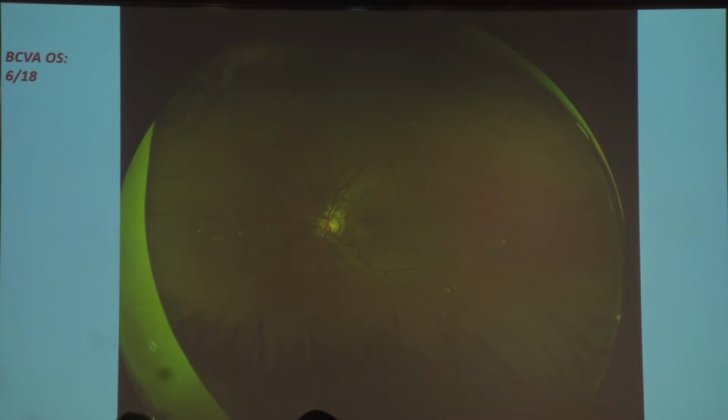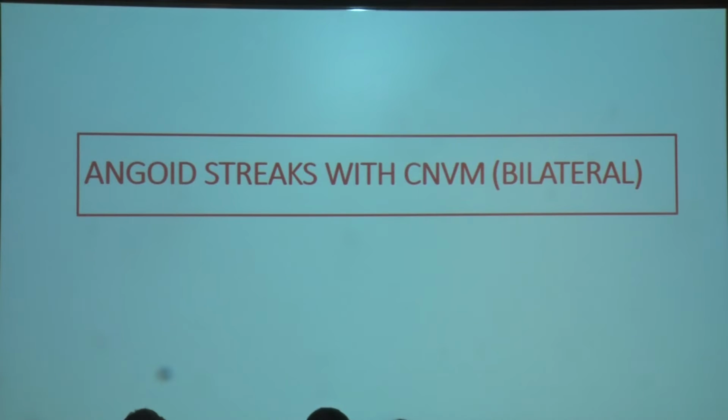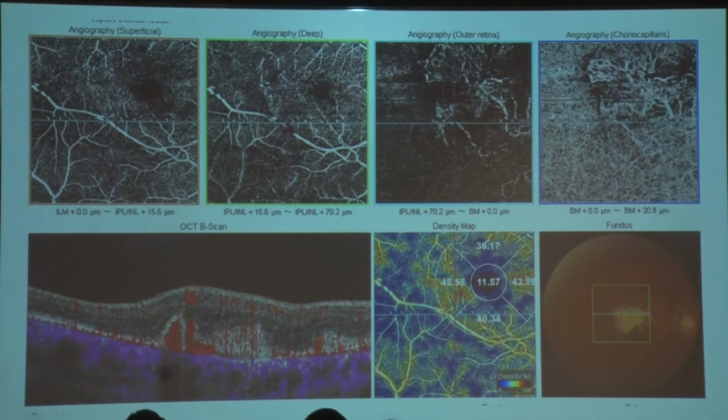When we look at the other eye, again a similar picture is visible. Black lines emanating from the optic disc and going radially outside. The left eye also shows some pigmentary changes. So there is CNV, but the basic diagnosis changes. The patient has angioid streaks, and that is why the patient had bilateral CNV at a young age. Fundus autofluorescence shows pigmentary changes in the posterior pole in both eyes. Also, the peripheral drusen are now identified as a marker for angioid streaks, so patients who have peripheral drusen tend to have complications of angioid streaks as well.